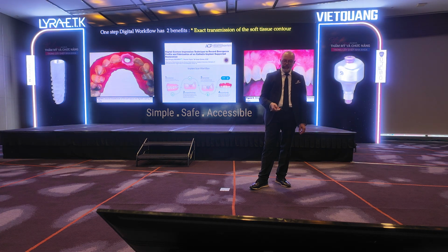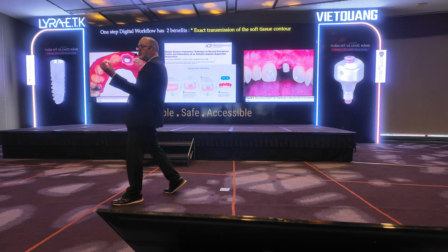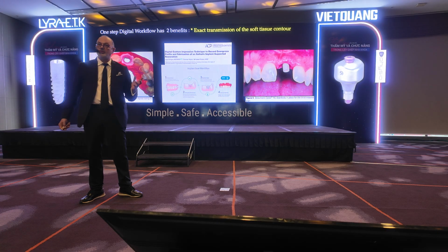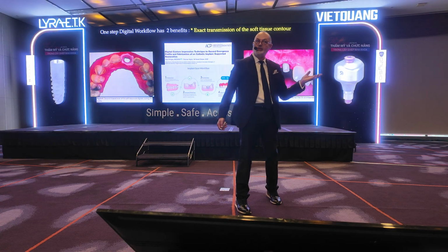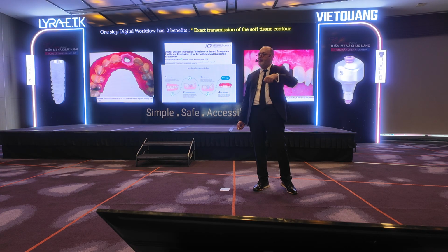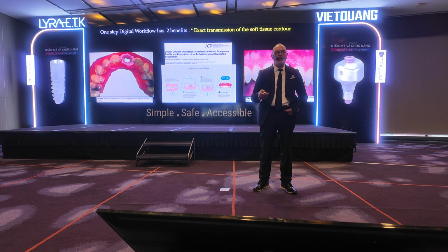And the other thing is that when we remove the abutment and we put the scan body, we always have a shrinkage of the soft tissue. When it shrinks, digitally we cannot do anything because the digital scan will take the final positioning of the soft tissue. And the lab technician cannot play like when you are on plaster. He can remove some of the plaster and make the emergence profile as needed. It is not the case.